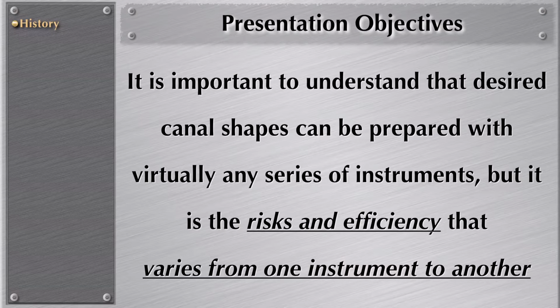It is important to understand that the desired canal shape can be prepared with virtually any series of instruments. But what is important is the risk and efficiency, which vary from instrument to instrument, and sometimes from company to company.